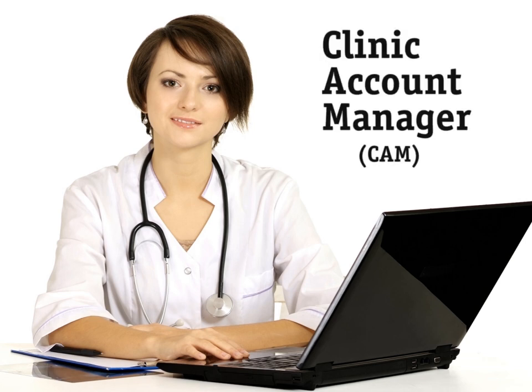First, you need to decide who in your clinic will serve as the clinic account manager. The clinic account manager should be your point person for Latitude NXT at your clinic. It's possible to have more than one clinic account manager, but we recommend you limit the number of users that have this level of access and responsibility.